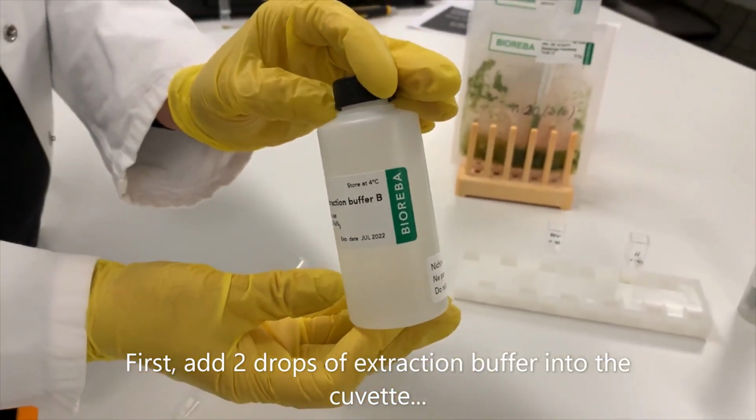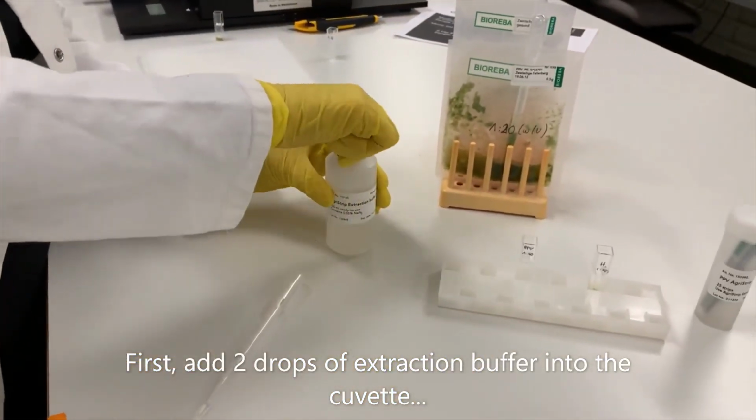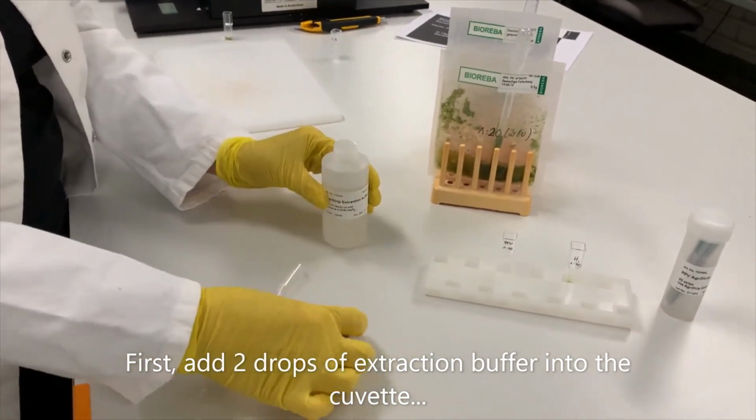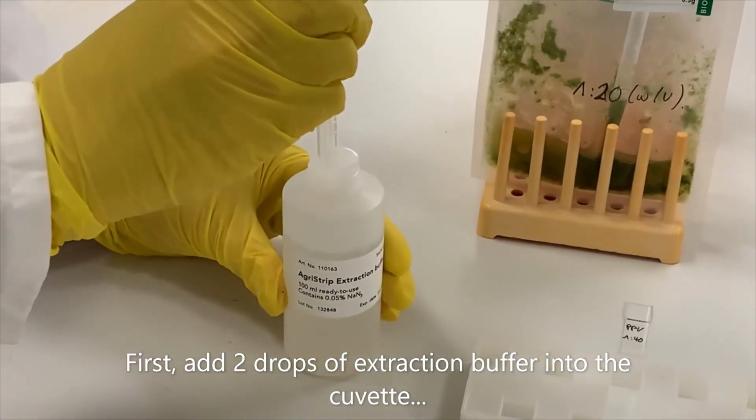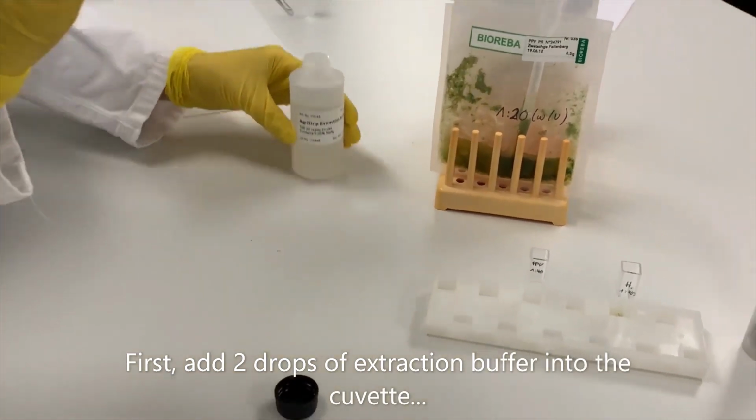The final dilution, as we recommend, needs to be 1:40 for Plumpox virus. Here we use again the extraction buffer B and do a dilution directly by adding 2 drops of buffer first into a cuvette.